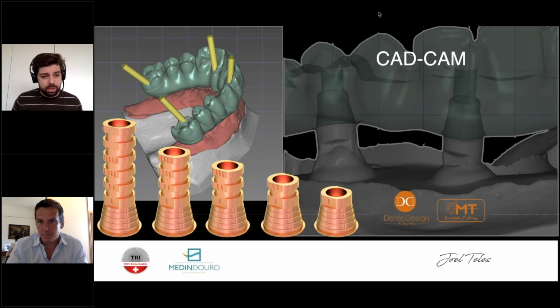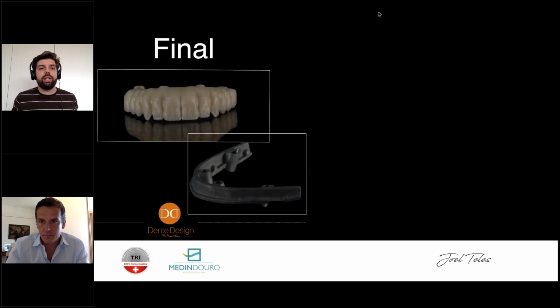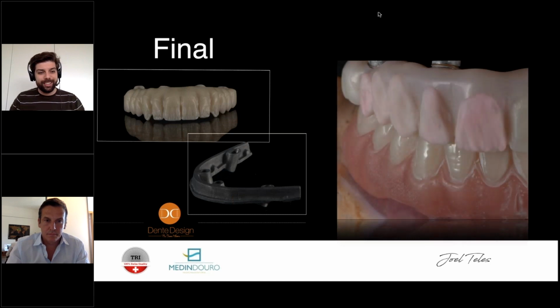We all make mistakes. So if we document everything and we're sure about every step of the way what we're doing, we'll end up with fewer problems in the future. And with monolithics, I learned the hard way that they are temperamental. Okay, so you need to be really careful with them. They are very stiff, very strong, but also very fragile.